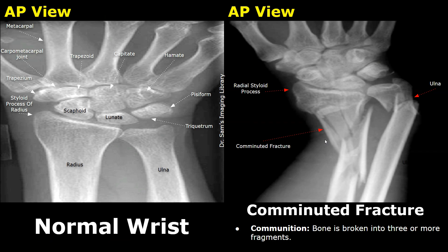Comminution refers to fragmentation. When the bone is broken into three or more fragments it is called a comminuted fracture. Here we can see multiple fracture lines in the radius with around four fragments. The ulna is also fractured.